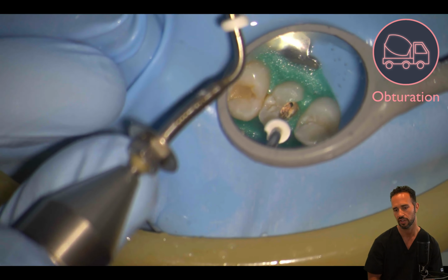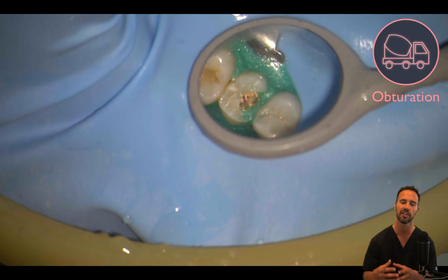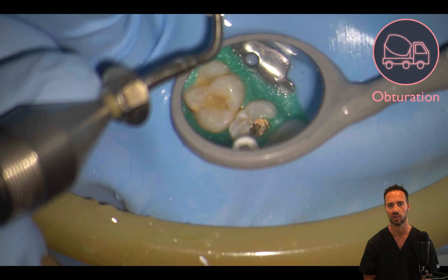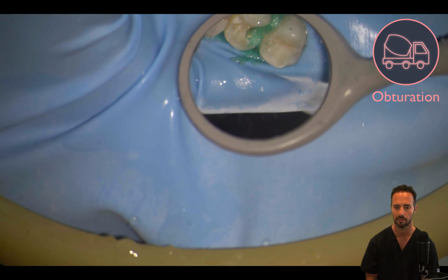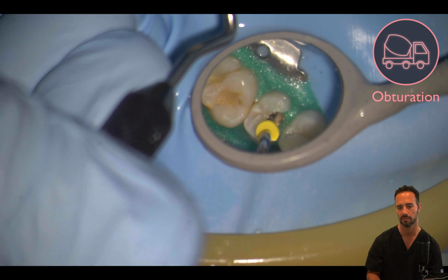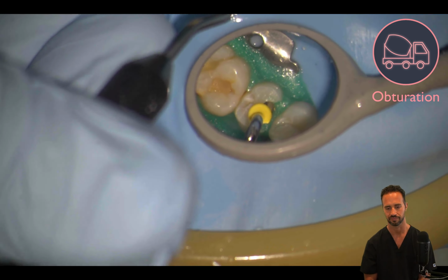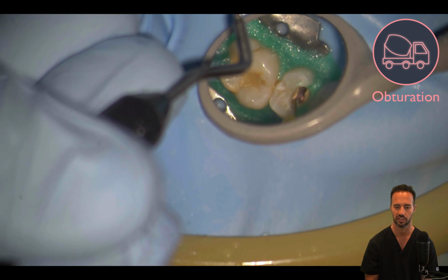But if you're going to be restoring your cases right away, do yourself a favor, give yourself a nice, clean foundation to work with, and don't cut any corners. I don't recommend cutting any corners. Just doing everything properly in a super time-efficient manner. All right, and sometimes the cleanup job takes a fair amount of time. That's okay. Do it right the first time. But that's starting to look obviously like a nice finished product.